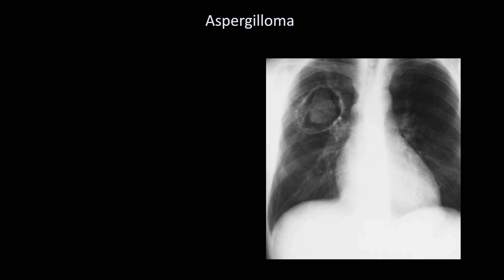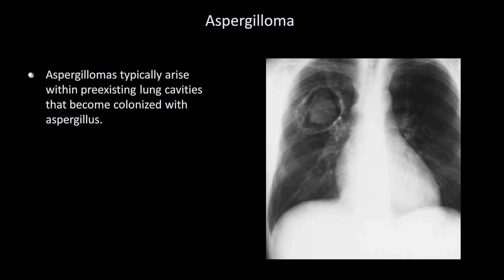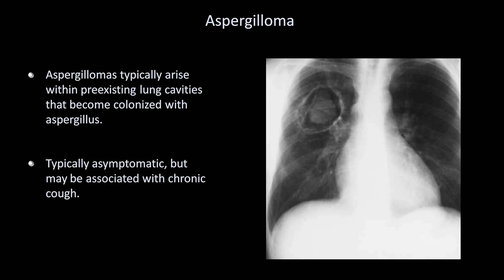One cavitary-like process worth mentioning is an aspergilloma. Aspergillomas typically arise within pre-existing lung cavities that become colonized with aspergillus. Like pneumatoceles, these can be surprisingly asymptomatic but may also be associated with chronic cough. These are also known as fungus balls.